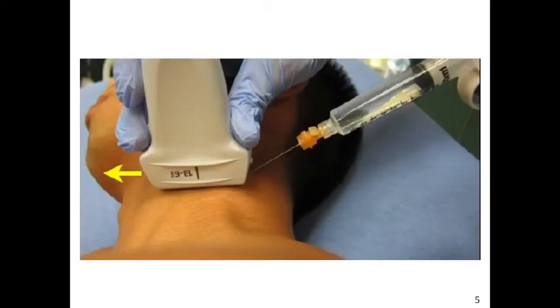After the anatomy is identified, you can set up to perform the block. After skin sterilization, a skin wheal can be placed for patient comfort, and then the needle is inserted as shown here from the posterior aspect of the patient using an in-plane approach. The probe can be slid anteriorly, as shown in the arrow here, as the needle is advanced to keep that needle tip in view.